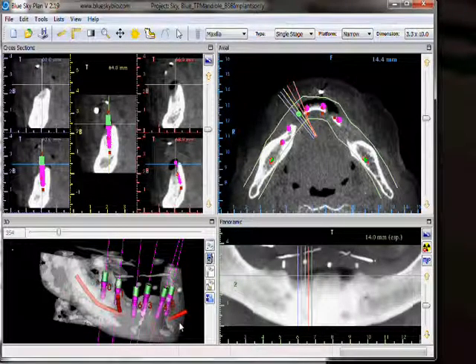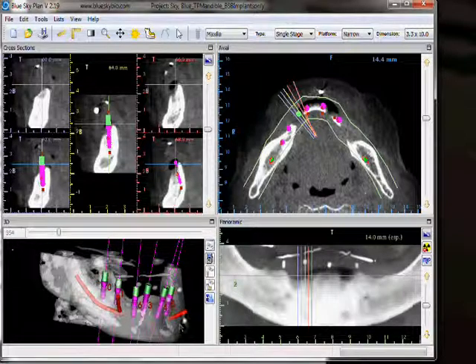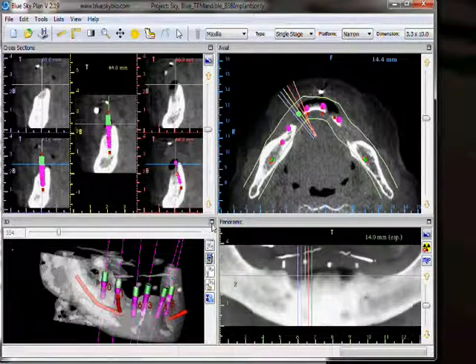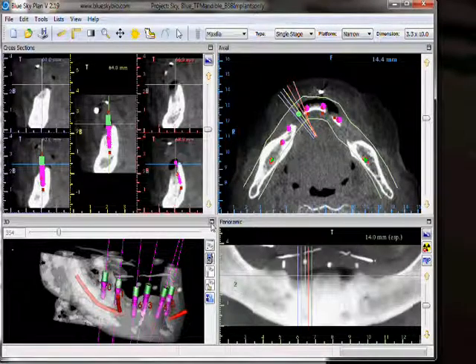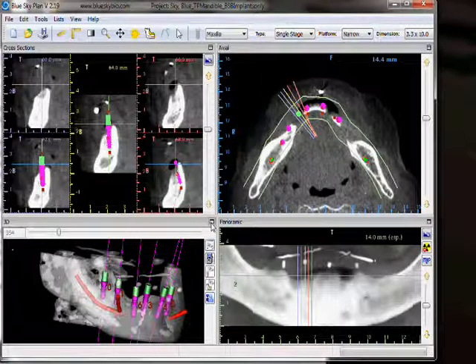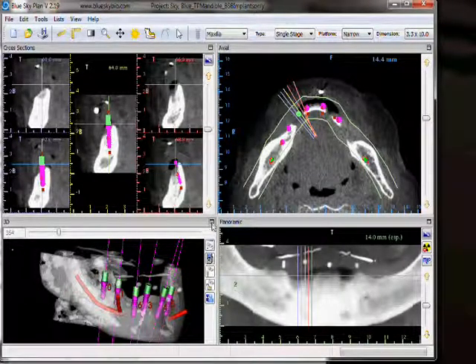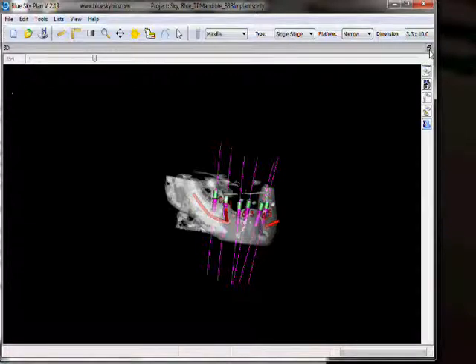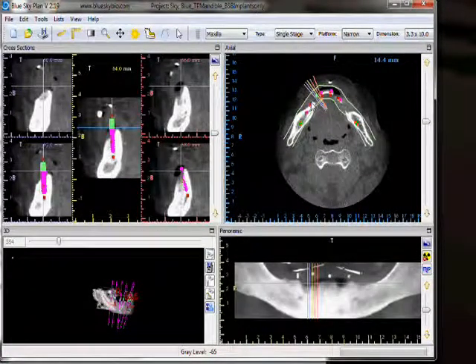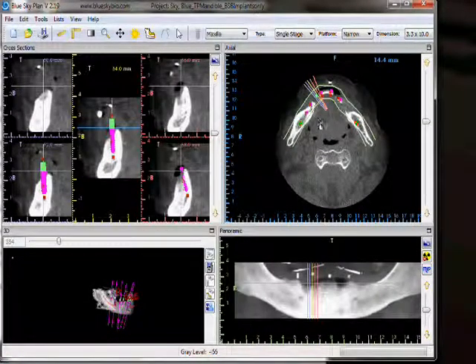Each view can be enlarged to take up the entire screen by clicking on the black box in the top right of that particular view. The view can be returned to its place by once again clicking on the top right icon. This concludes the screen overview tutorial.